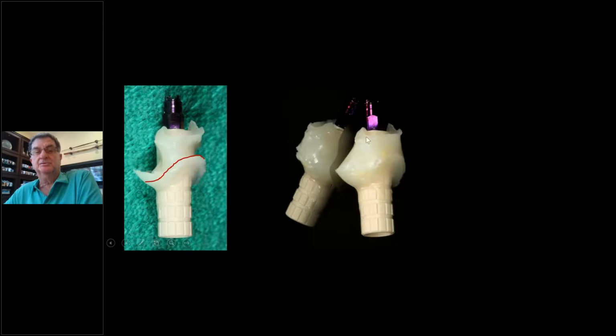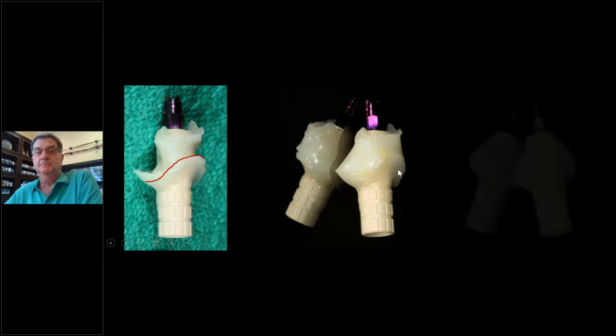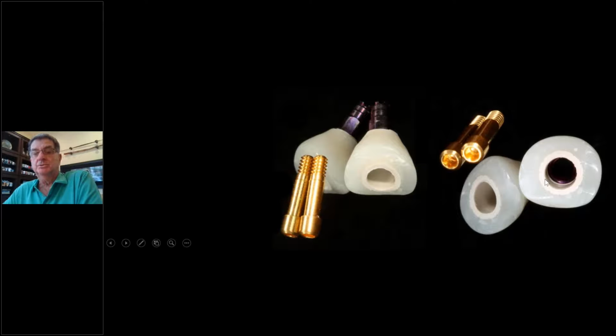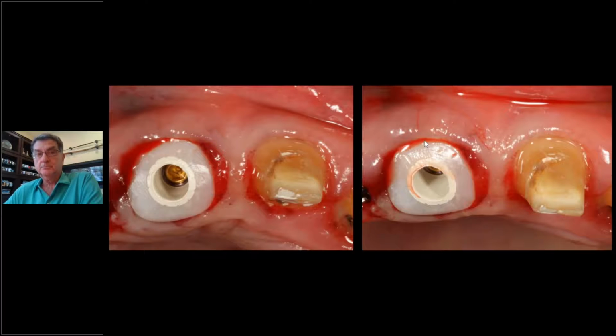And see the eye shell, now you first take it out, get rid of the blood, and then you fill in the voids, as you see here. Fill in the voids. Then in this case, we're not going to put the temporary on top because it's not necessary in this case. It's just going to put a custom healing abutment on. So I'm going to show this to you. We cut this off. We mark it. We mark the height of the free gingiva, and we cut it off, and this is what we're ready to put in. So here's what the custom healing abutment is that was made. The eye shell will make this much quicker. We put this in. Now, of course, this is a lot of inflamed tissue from the day the old bridge is coming off. So it's a lot of inflamed tissue. But it holds the tissue out.